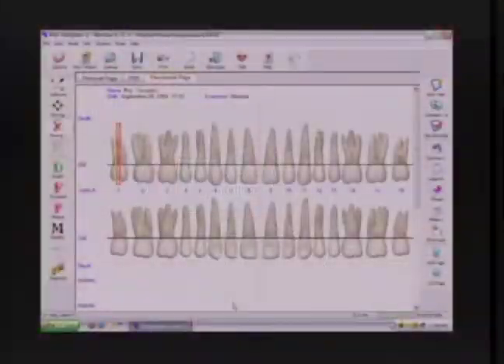Yes means I'd like to go in manually and enter the dentition. And remove third molars with the center pedal is a shortcut. It takes the third molars out and stays in the mode to record the additional dentition. So I'm going to go in manually. I'm going to say yes with the red foot pedal. Entering missing teeth. Now I'm generally doing a mouth mirror exam. The cursor's on 1, so I can remember the dentition for 8 teeth. So from 1 to 8, what do I have? And now I'll record it with the foot pedal.